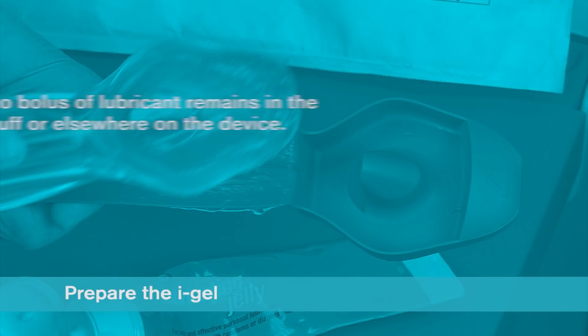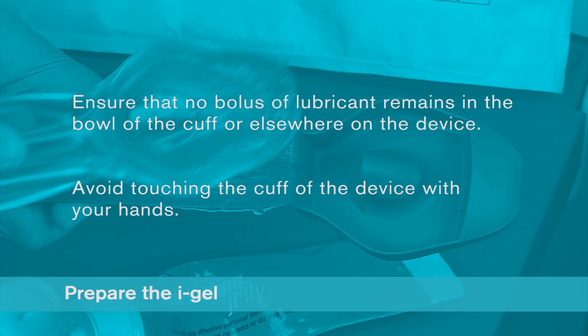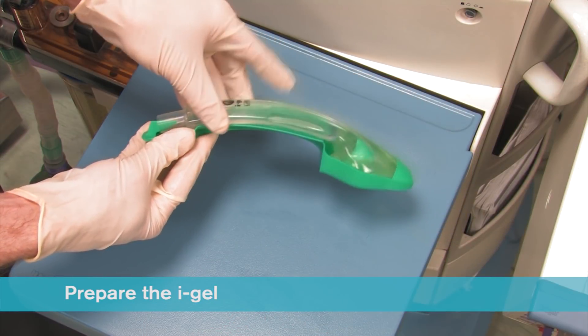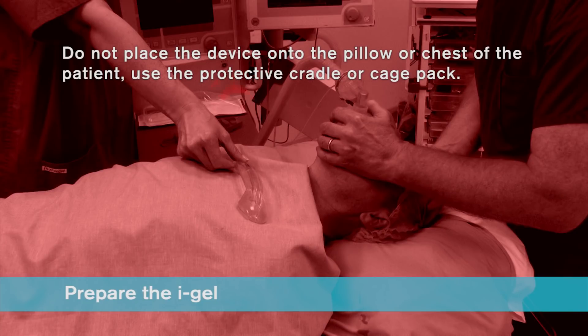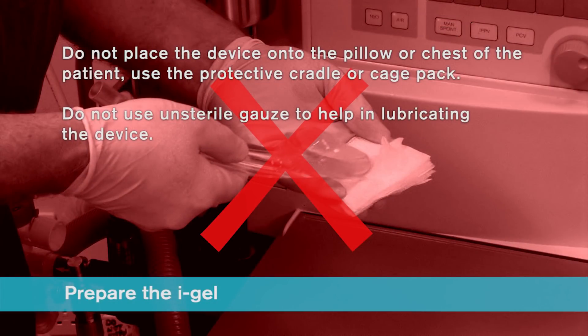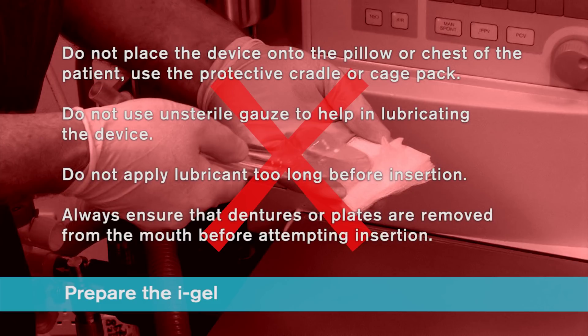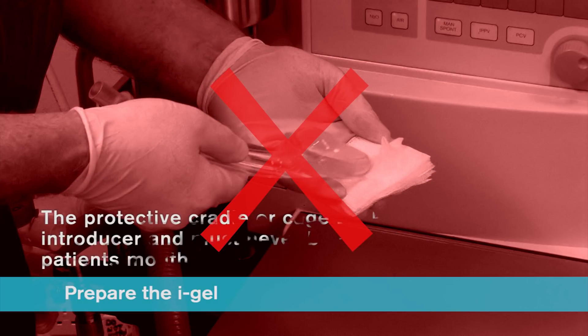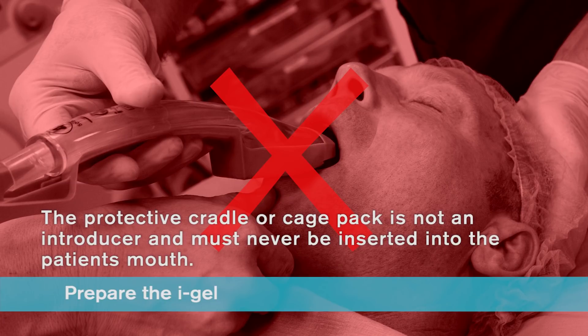After lubrication has been completed, check that no bolus of lubricant remains in the bowl of the cuff or elsewhere on the device. Avoid touching the cuff with your hands. Place the iGel back into the protective cradle or cage pack in preparation for insertion. Do not place the device onto the pillow or chest of the patient — always use the protective cradle or cage pack. Do not use unsterile gauze, do not apply lubricant too long before insertion, and always ensure dentures or plates are removed from the mouth before attempting insertion. The iGel must always be separated from the protective cradle or cage pack prior to use, as these are not introducers and must never be inserted into the patient's mouth.